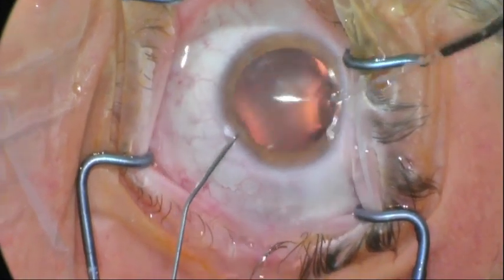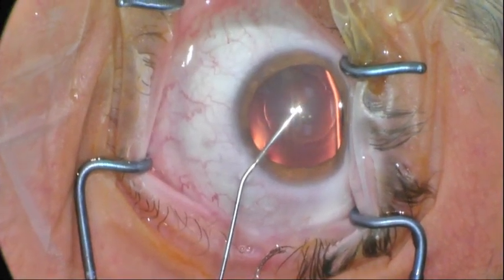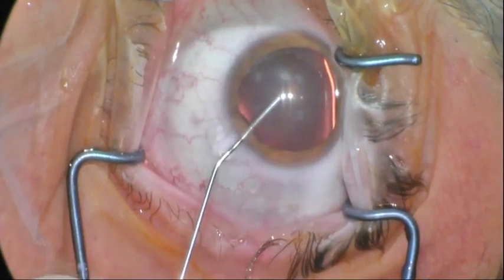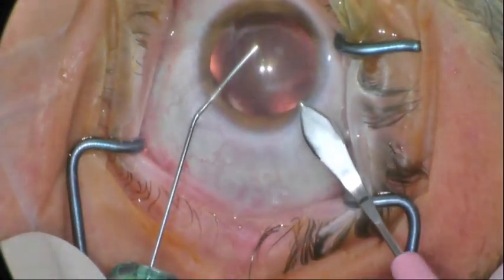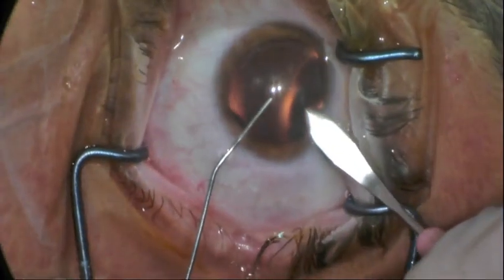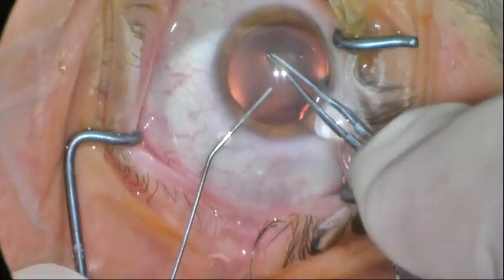Hydrodissection, hydrodelineation, lens manipulation, rotation, or even cracking can lead to pressure and rupture of the posterior capsule. To avoid this, we'd like to have a technique where the pressure is not exerted on the posterior capsule, but rather is transmitted through the lens, giving us the advantage of weakening the lens as we proceed.